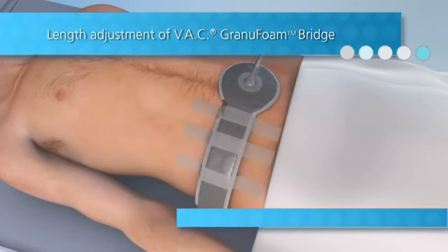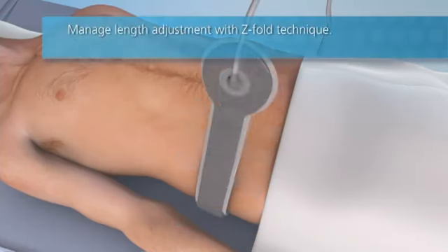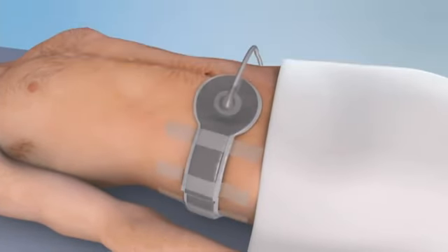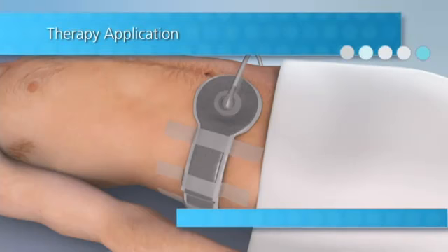Length adjustment of V.A.C GranuFoam bridge. Manage length adjustment with Z-fold technique. Therapy application.